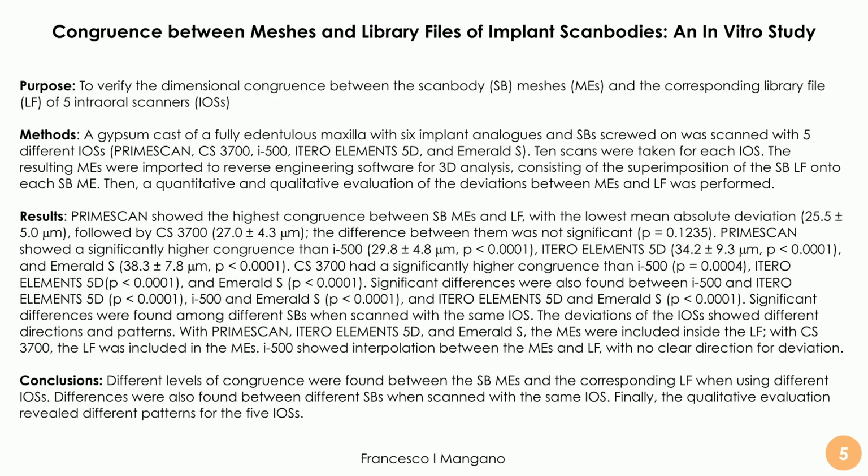The single operator, in this case me, captured 10 scans with each of these intraoral scanners. We also used a desktop scanner capturing 3 scans. And then the resulting meshes were imported inside a reverse engineering software for 3D analysis.